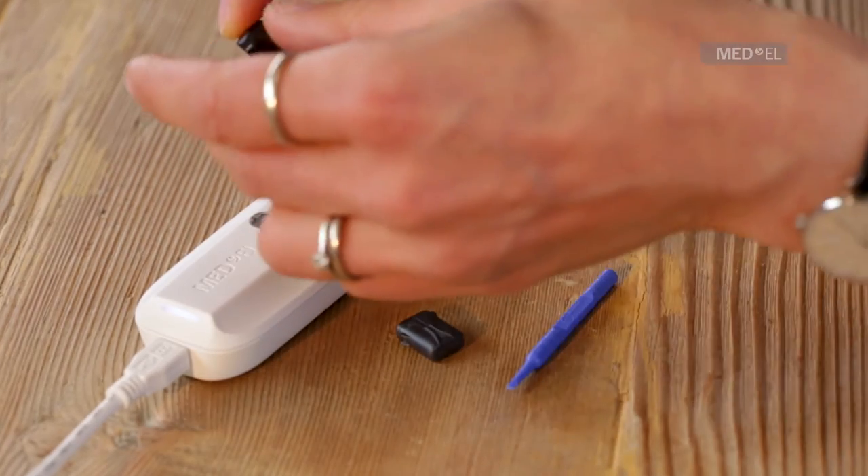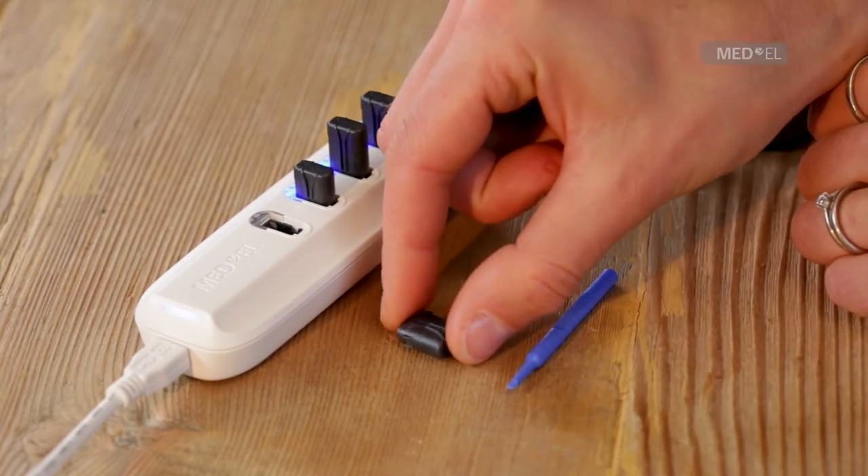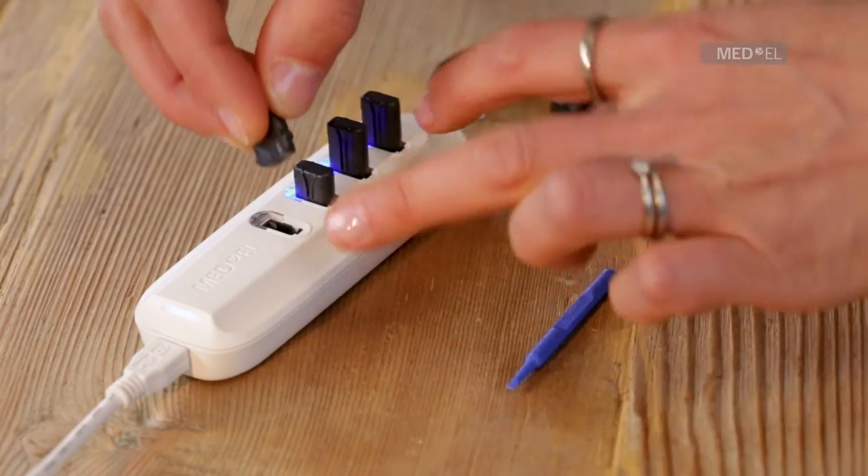Do not press hard. If the battery is lined up correctly, it should fit easily into the charging slot. The blue indicator light shows that the battery is charging.